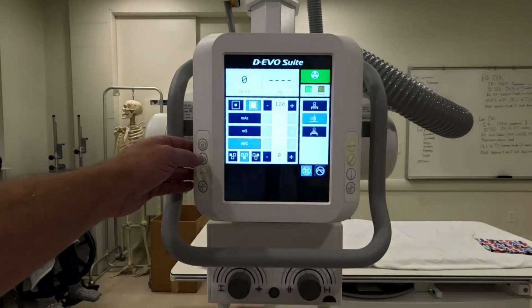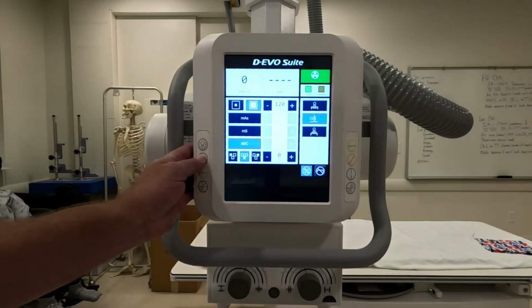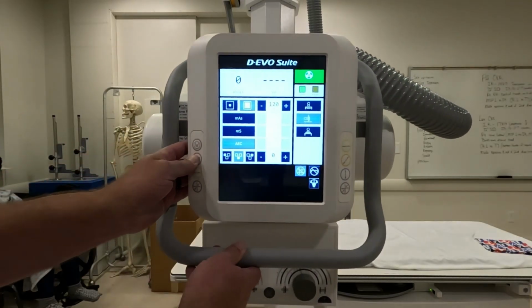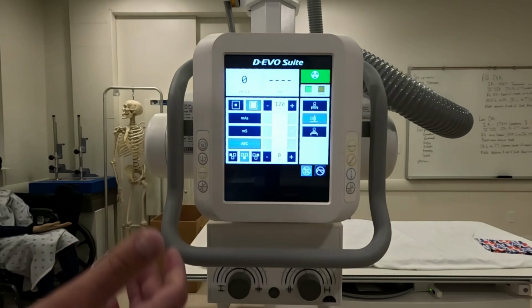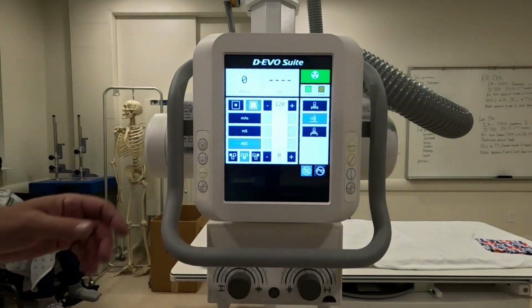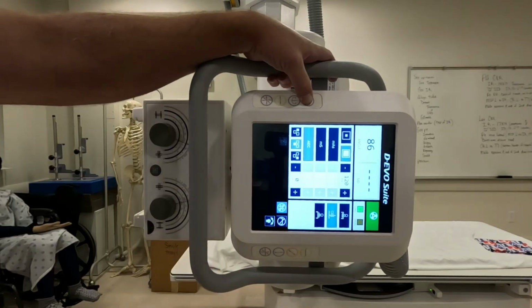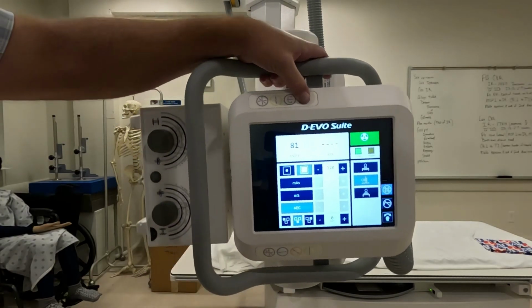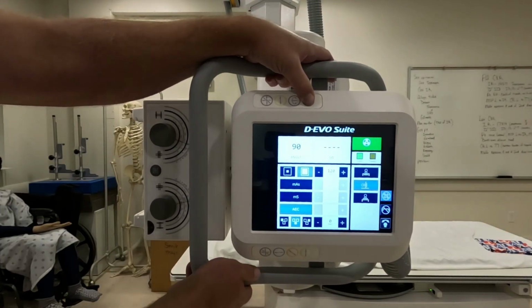This button is one that you're going to use if you're having to do things like decubitus or cross table exams. So you hit that one and the X-ray tube will swivel around that way. This one pivots the X-ray tube. So where it's pointing at the floor right now, if you needed to point it at the wall bucky, you could turn it just by pushing on that button. And notice it's got a lock in, so it secures itself pretty sturdy at 90 degrees.